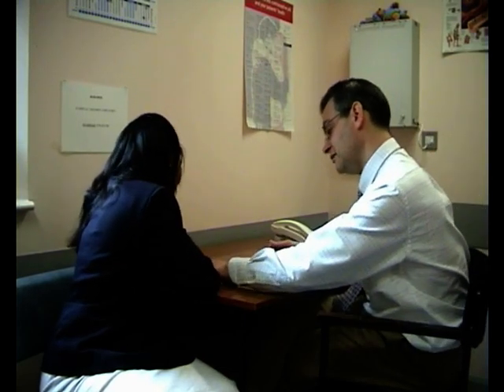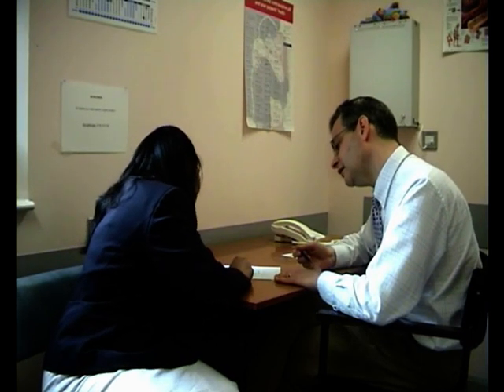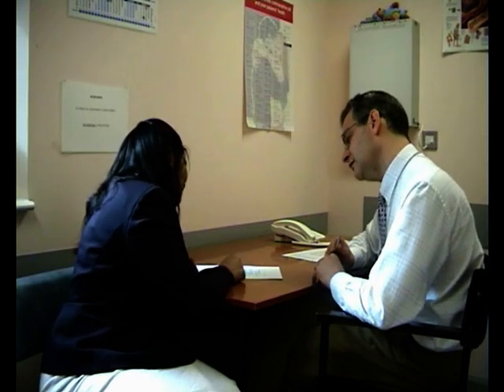And there are 4 phases. First is the voiding graph. No, this is a cystometry. Yes, as you say, the first part of the free flow studies here. I can see from this trace it's quite easy to miss that, but it's this section here. And what are the other 3 phases you were going to tell me? The filling phase. And where is that on this graph? From this line. Yeah, this is the filling here, till here. That's right. Okay. And then this is the.